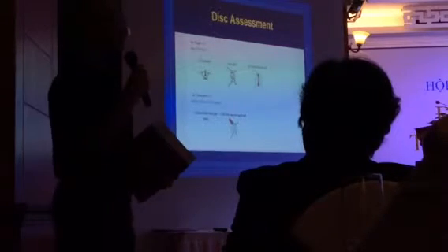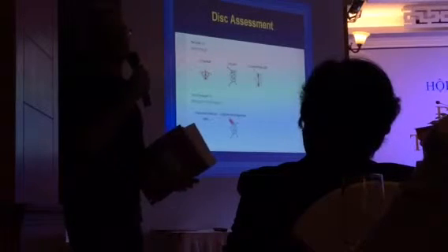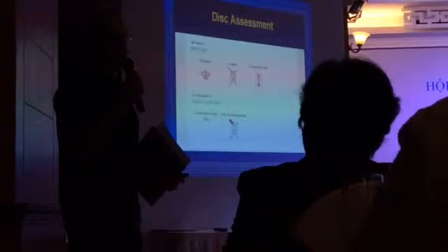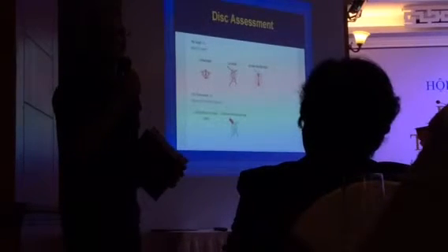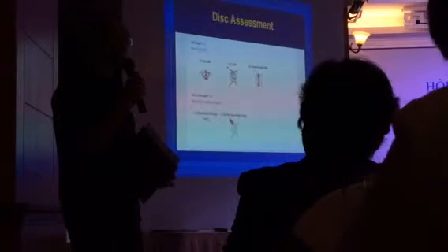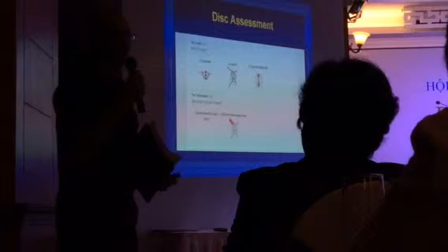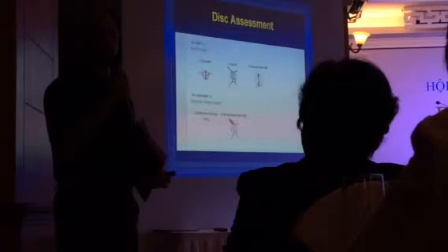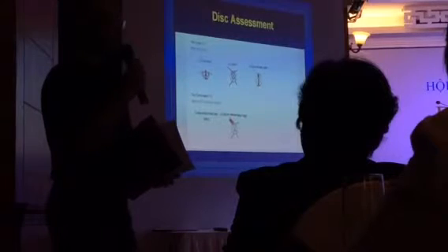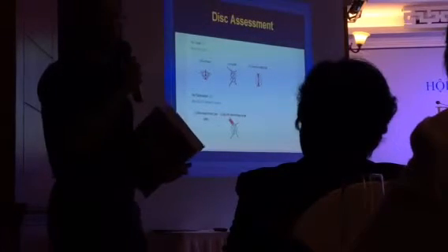So practice, practice, practice. The more discs you look at, the better you will be. Your experience really is better than any machine, any technology. It's important to have a look at the disc and make up your own mind. You can then confirm it with the OCT, and that's also another way you can assess yourself: if you're picking up the same defects, the same problems as the scan does, then you know you're doing well.